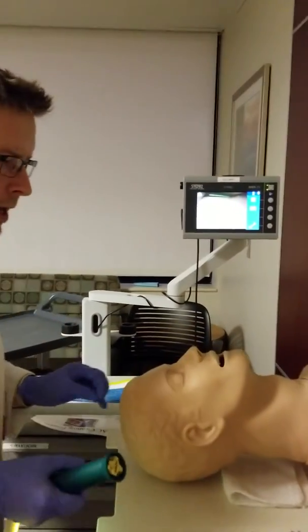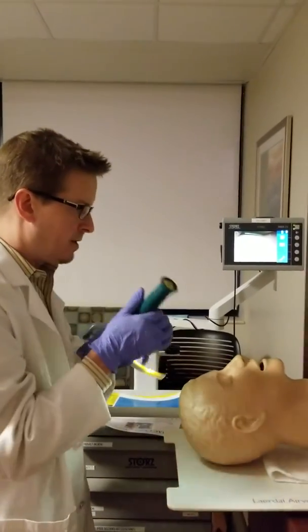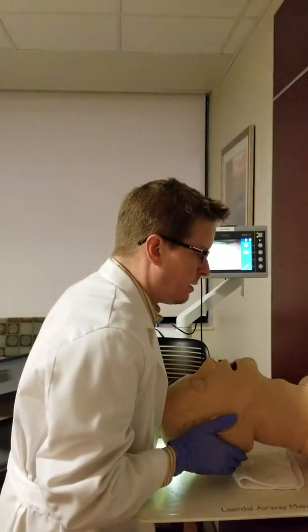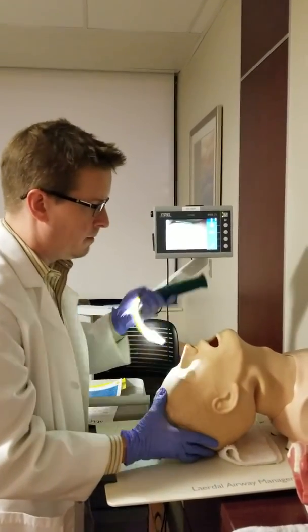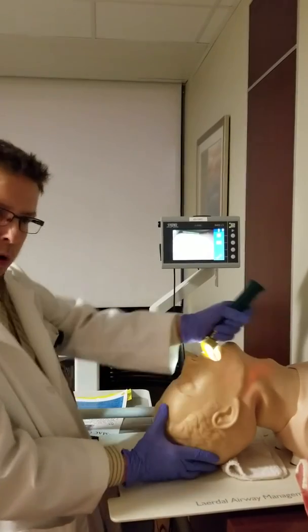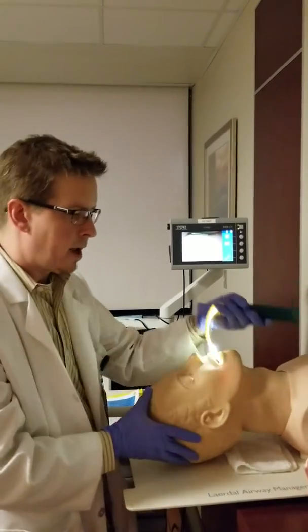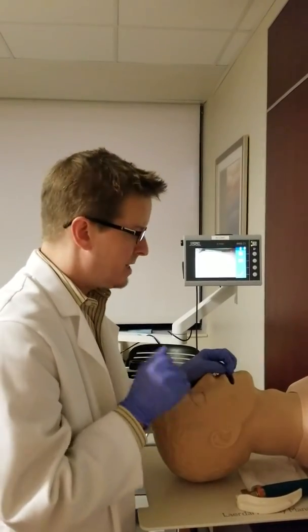So the other big thing is that most of the time your adrenaline is pumping, you're thinking you've got to get the blade in there, and you're concentrating on getting the blade in there, but you've already forgotten to get the patient sniffing for you. Never pull back — always lifting and away. If you get the blade right at the vallecula of the tongue, it doesn't take much strength. It's all about technique and positioning.